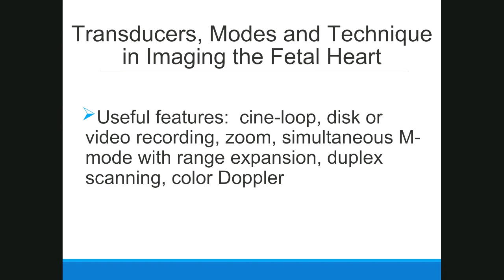You're going to do a lot of zooming if you're looking at very specific parts of the heart, the valves, the ventricular septum, the interatrial septum. M mode is used a lot in both fetal and pediatric echo. We use it some in adults, not as much as we probably should, but it gives a lot of really helpful information. So for those of you that do decide to come onto the cardiac track, you're going to learn a lot about M mode because we use it quite a bit.